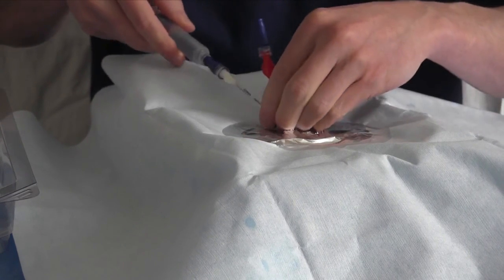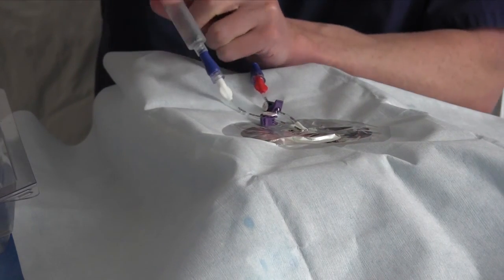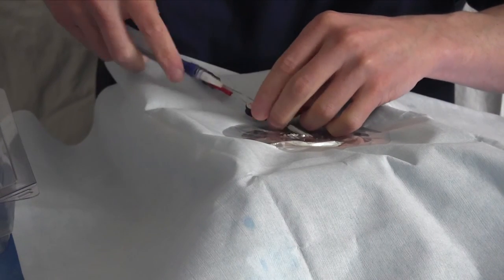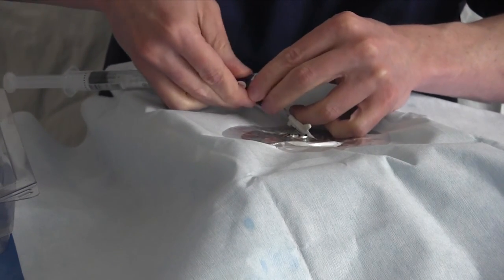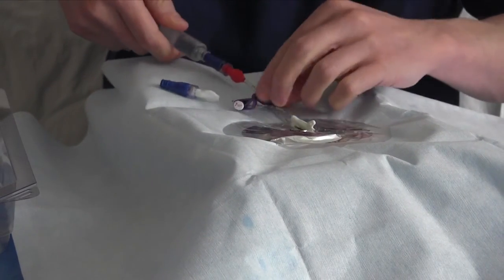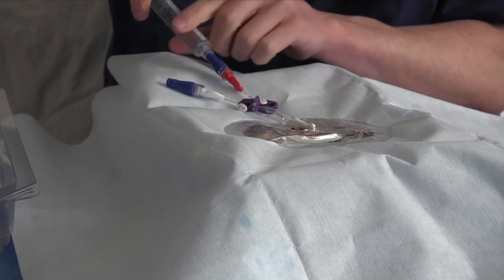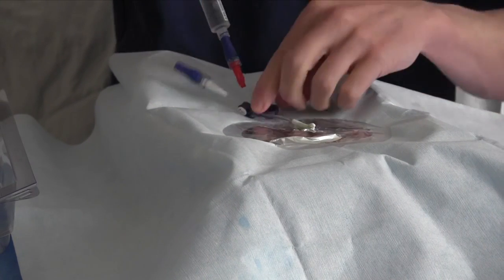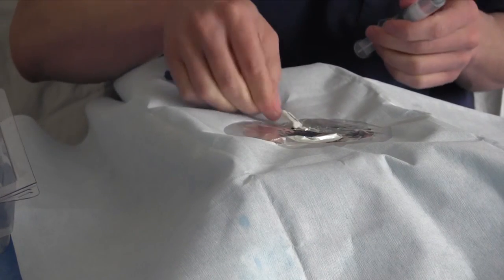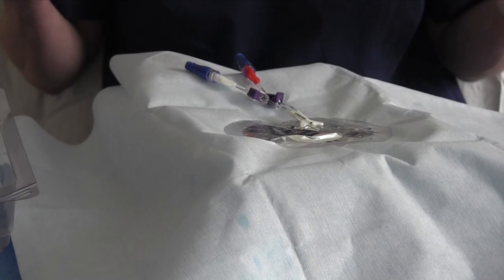And I'm going to make sure I get blood back, blood right here, flush. I'll go to the other blue cap, unclamp, pull back blood into this one, flush. And now I've made sure both of the ports are getting good blood return, and that tells me I'm in the right place. All right, now securing.